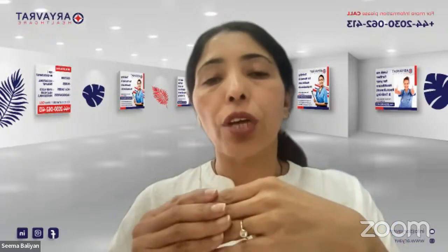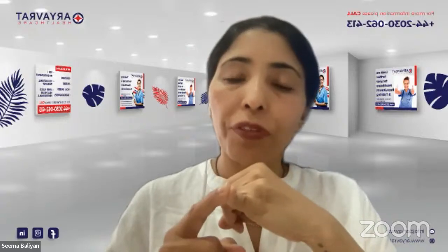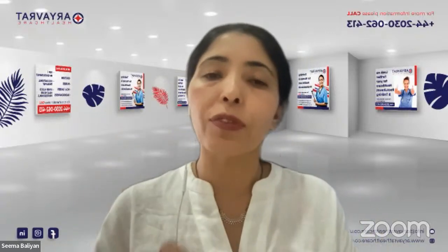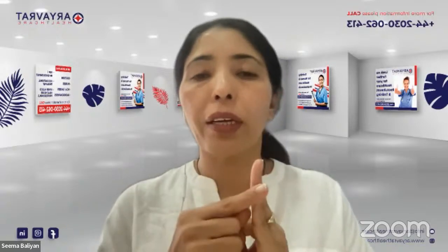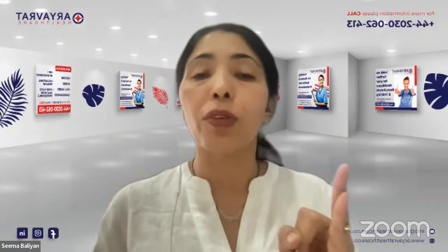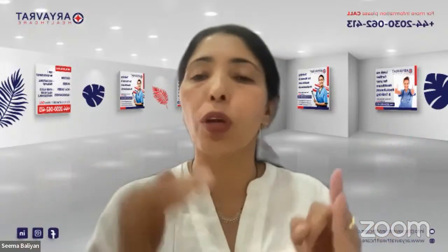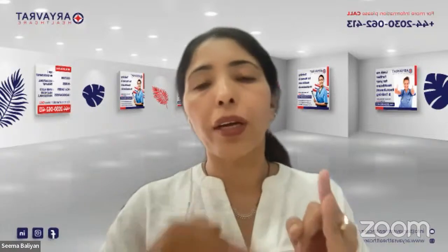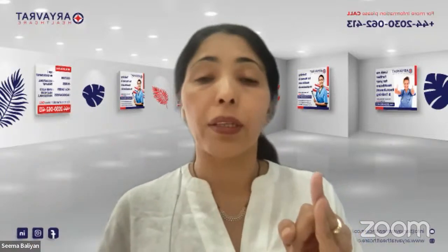And this chart is dependent upon 3 things. The first is the gender of the patient. For male and female, there is a different set of readings. Then the age of the patient, because the younger you are, the better the lung capacity; when you are around your 20s to 30s, your lung capacity is going to be at its maximum. As you grow old, your lung capacity is going to go down and down, even normal lung capacity.